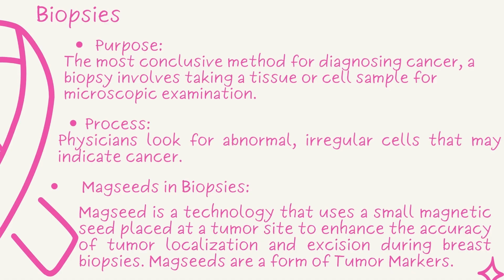Additionally, the mag seed serves as a form of tumor marker. This is especially useful in cases where chemotherapy has eradicated the tumor, making it invisible. Physicians rely on the mag seed to pinpoint the physical location where the tumor once was.